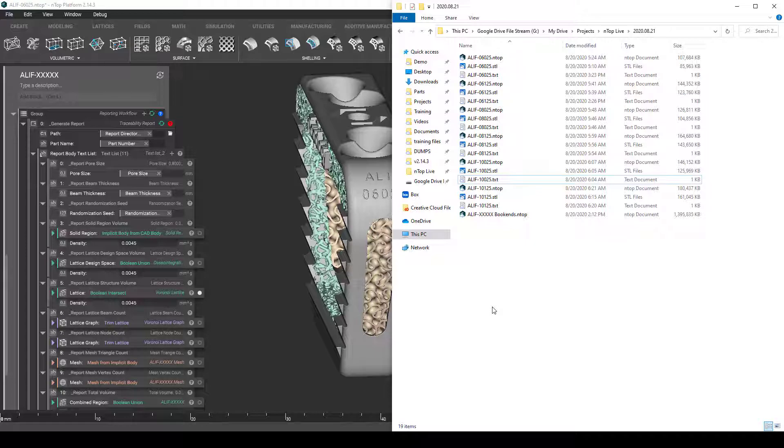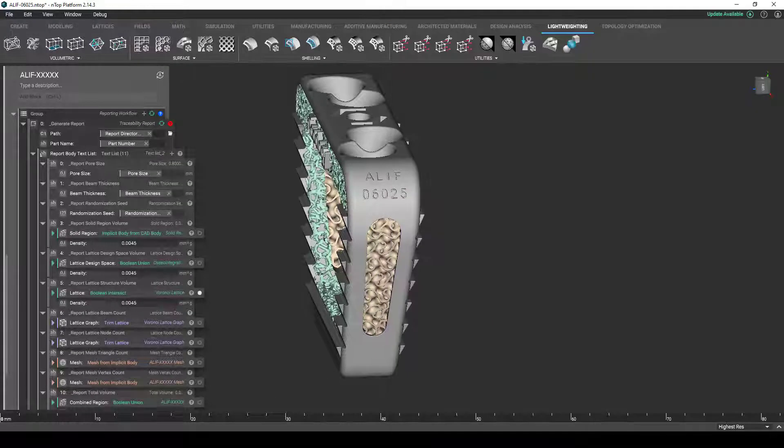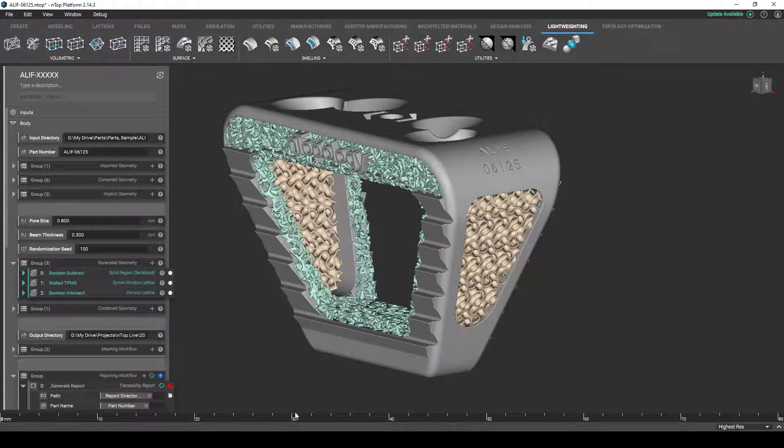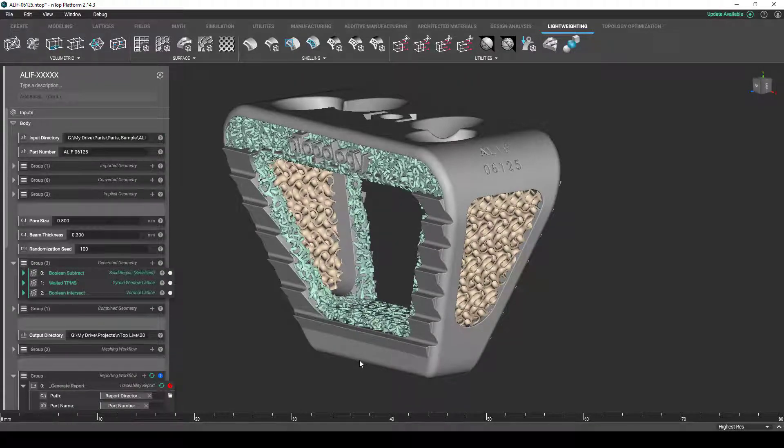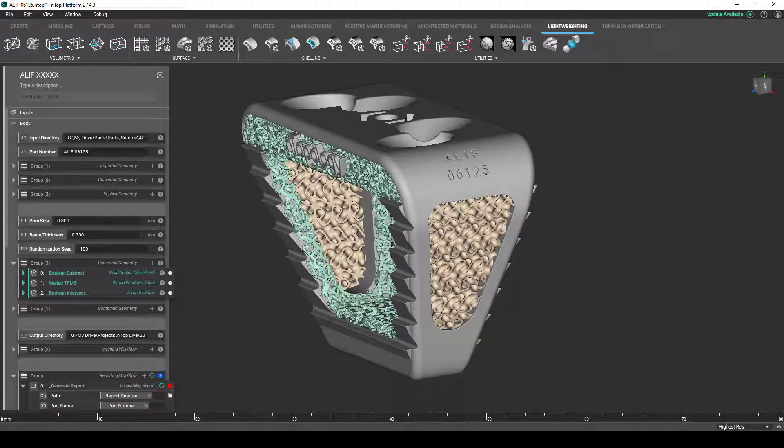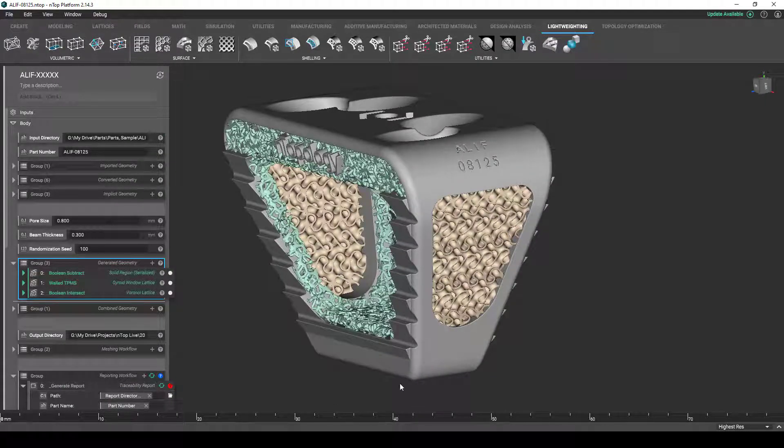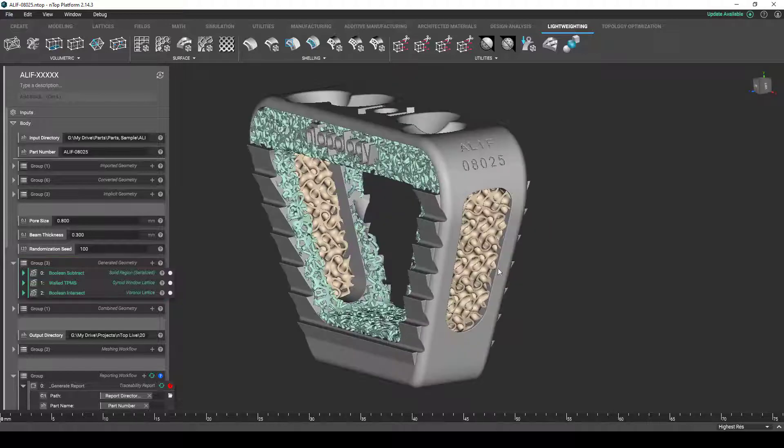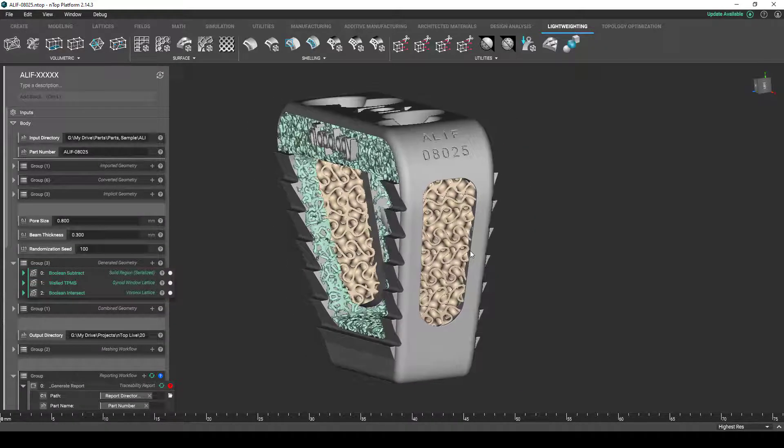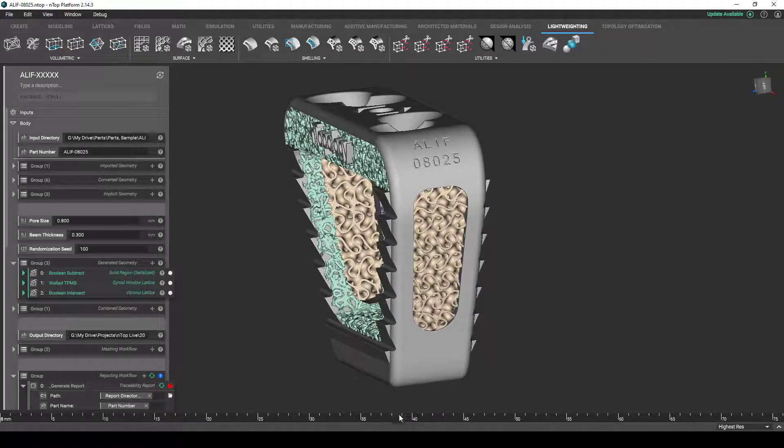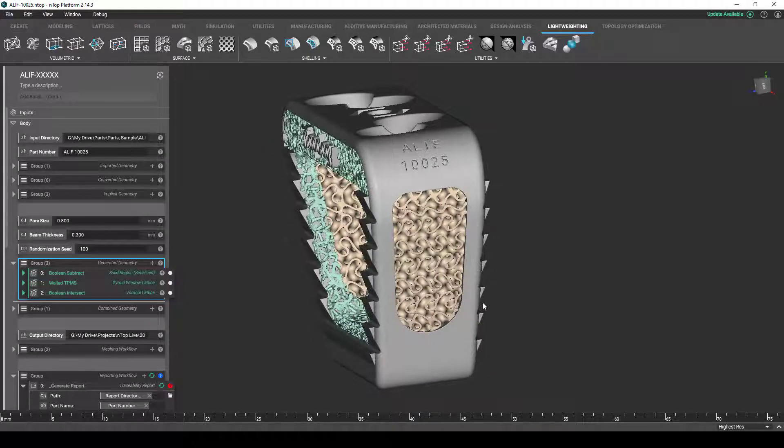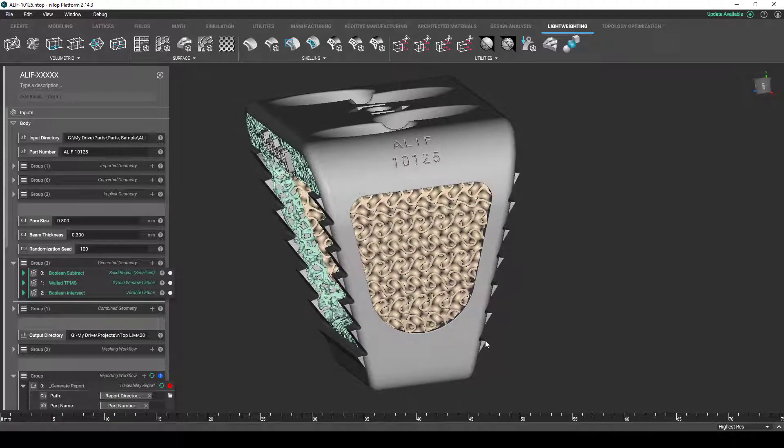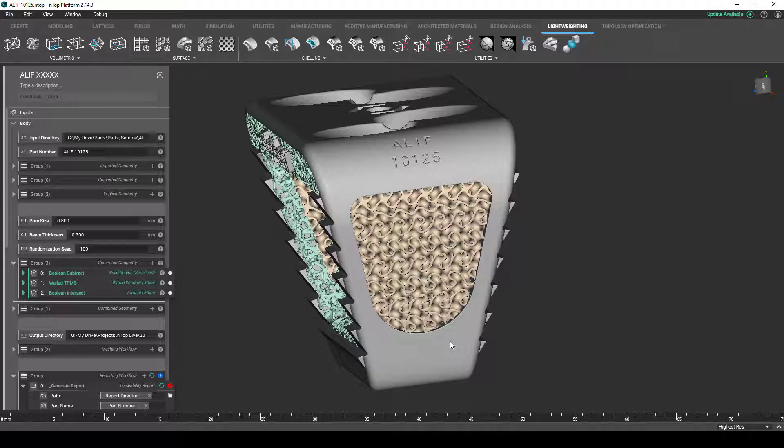Now, obviously at the production level, you wouldn't just do these bookends, but as you can see, as I've jumped through all these files, so this is the 06125, the 08125, the 08025, the 10025, and the 10125.